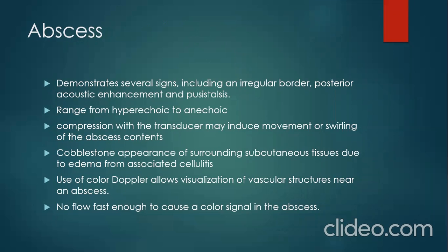So we might get edema and a cobblestone appearance in the subcutaneous tissue surrounding the abscess. And if we use color Doppler, it allows us to visualize the vascular structures near an abscess, but there's no flow that is fast enough to cause a color signal inside the abscess itself.